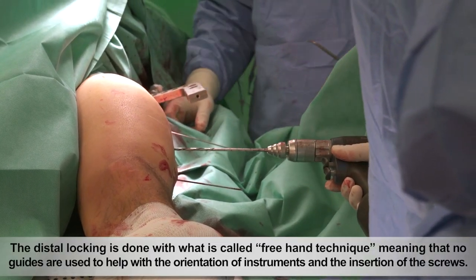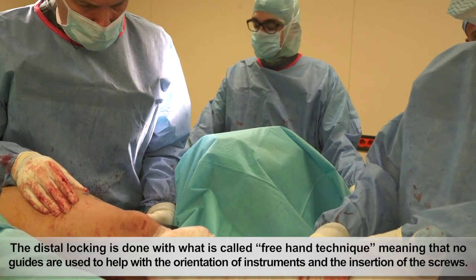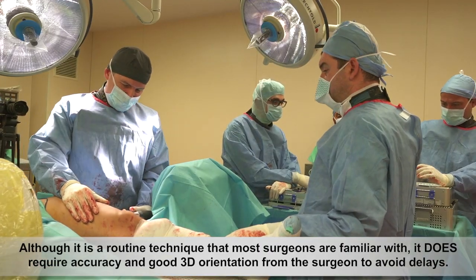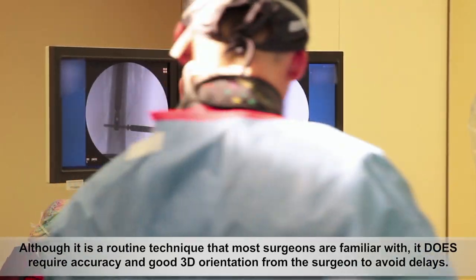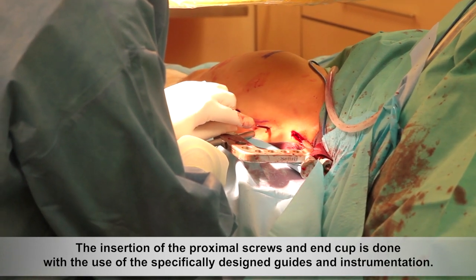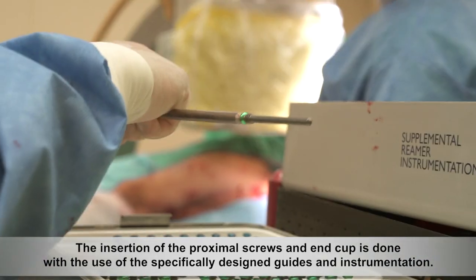The distal locking is done with what is called the freehand technique, meaning that no guides are used to help with the orientation of instruments and the insertion of the screws. Although it is a routine technique that most surgeons are familiar with, it does require accuracy and good 3D orientation from the surgeon to avoid delays. The insertion of the proximal screws in the end cap is done with the use of specifically designed guides and instrumentation.